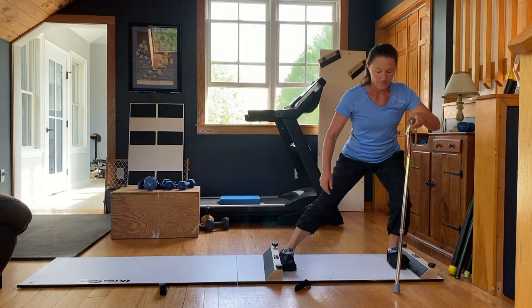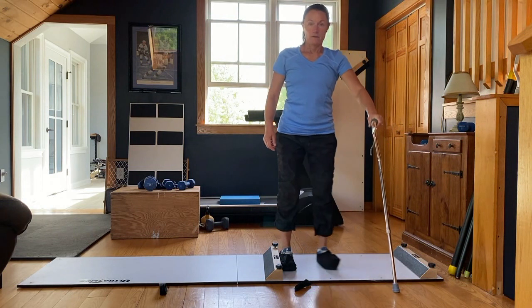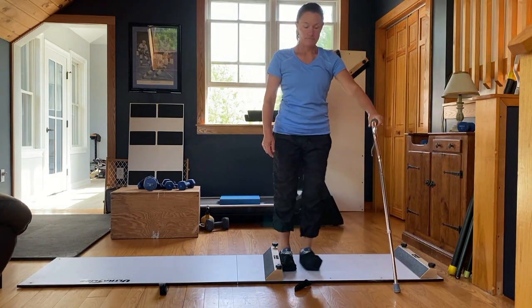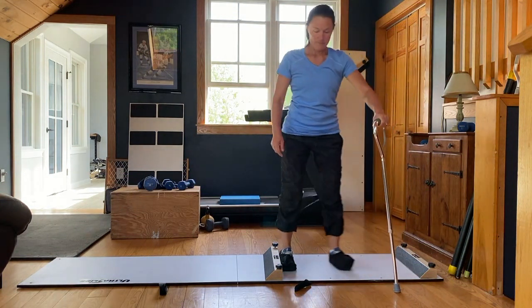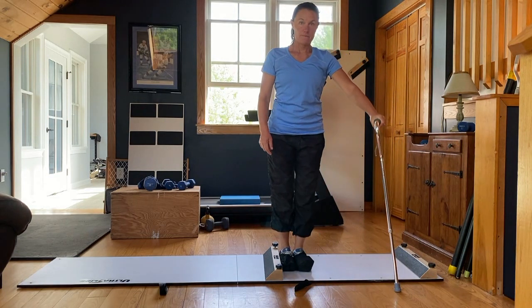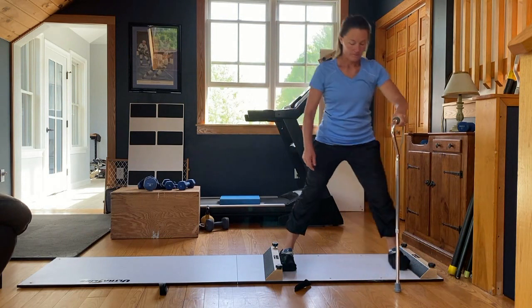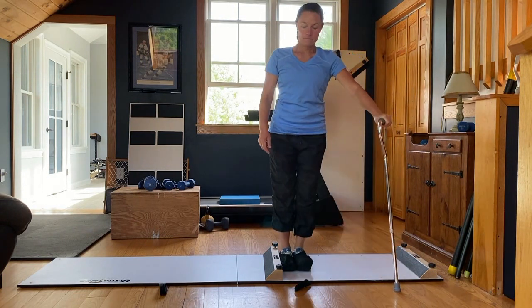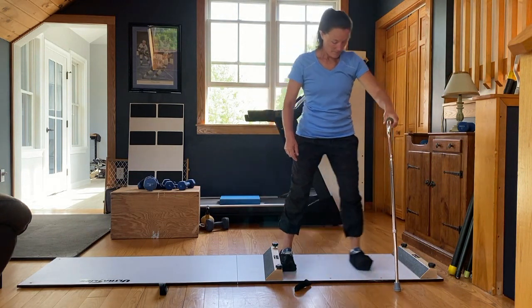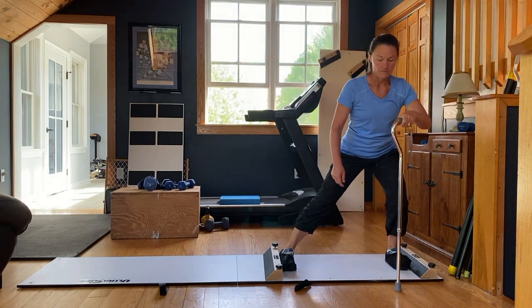So in this example, you can see Christy sliding her left leg out. Once again, her right foot is secured up against the block or the bumper, and it's that left foot that she's shifting her weight onto. And you can see as she bends that left knee, how nicely aligned her left shoulder, her left hip, her left knee, her left ankle, everything is in alignment. She's got some support through a cane here as needed, but it's shifting into the sliding leg, and the trailing leg stays basically straight. So this is her left leg really doing the work.